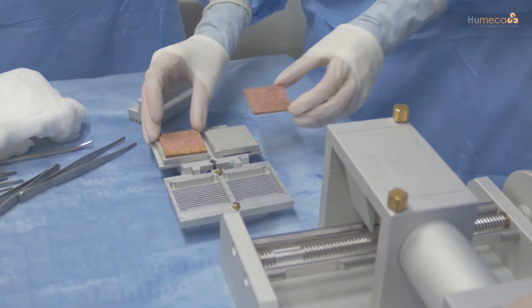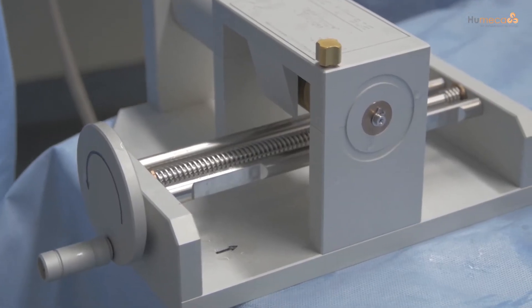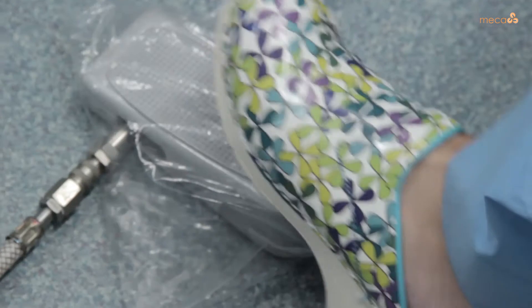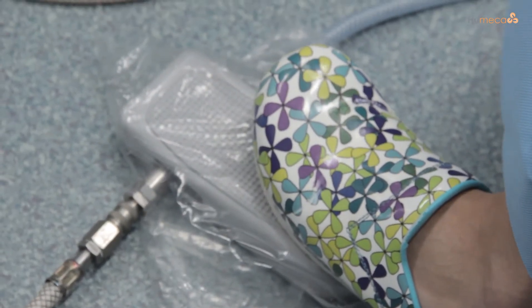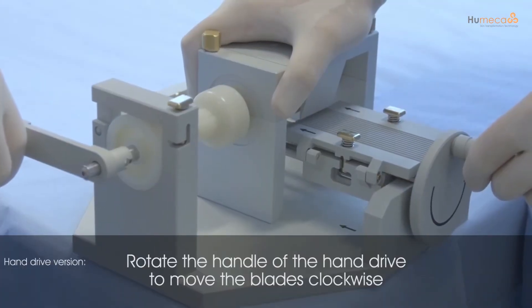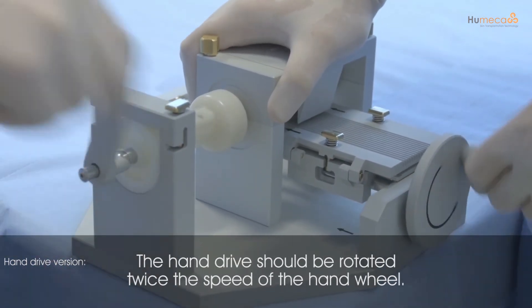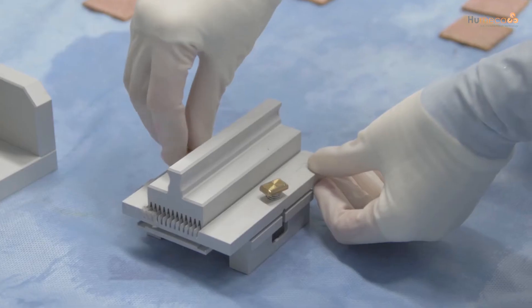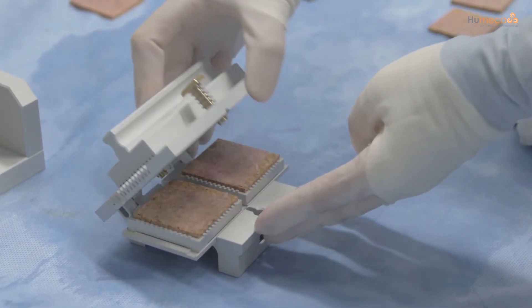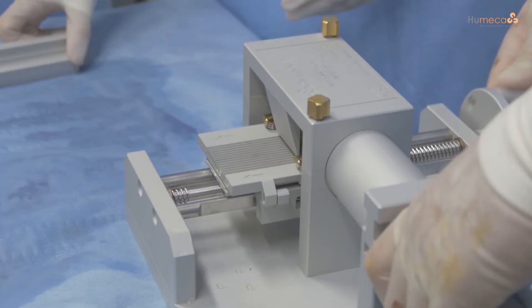Open the double block and place the skin into the cutting block, then moisten the inside of the cover. Ensure that the cutting block is placed on the Meek machine at the side of the hand wheel. For correct positioning, use the arrow indicator on the double block. Activate the motor of the motor-driven Meek by pressing the foot pedal completely down, and simultaneously rotate the hand wheel to move the cutting block under the bridge. Place the supported wedge on the double block and open the screws, then push it downwards while slightly lifting the cover. The graft will come loose from the cover. Make sure that each cork holder is rotated 90 degrees after the first cut and then passed through the machine again.